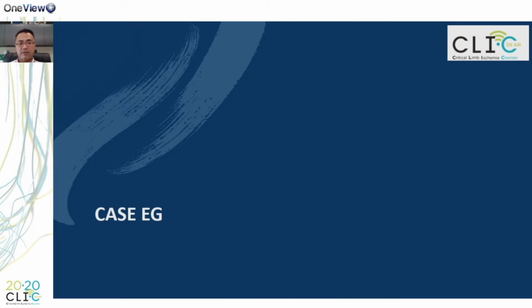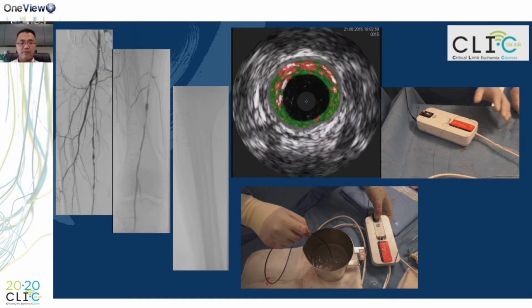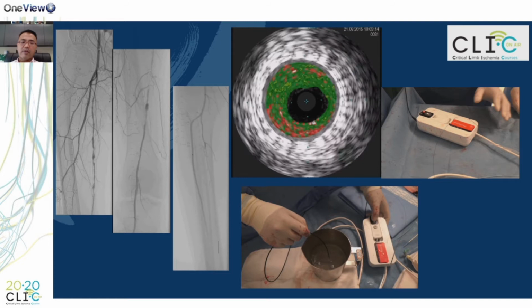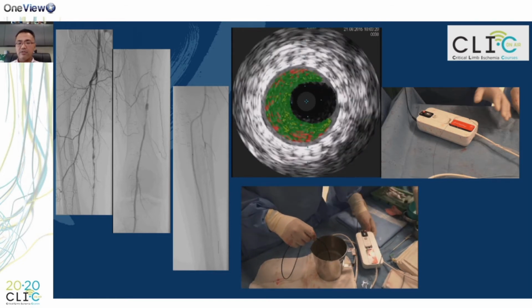Next slide, please. Just a simple case example. I'll move quickly through this. This is a diffuse in-stent restenosis, a Tosaka class 2, I believe. With IVUS, you see a lot of material within the in-stent restenosis. In the video, you can see the effect of the rotation is quite significant. And this device also has a wire system that allows the wire to remain in place.